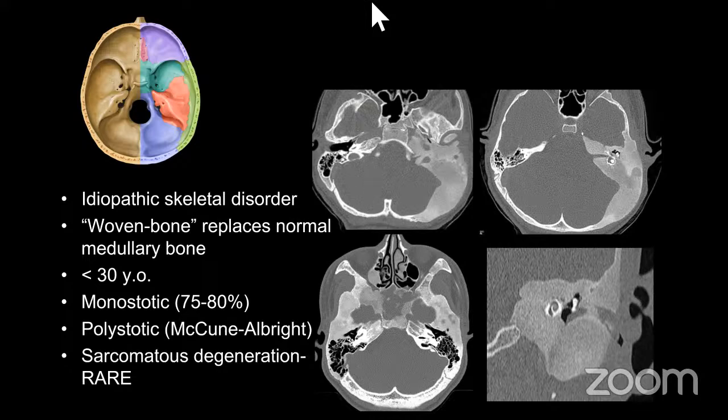Now, granted, sometimes you can't be 100%, but if you are dealing with an experienced skull base radiologist, you can see that the cortex of this bone is actually pretty well intact. And then on the non-contrast T1-weighted images, we can see these focal areas of fat. And on the T2-weighted images, you can see this bubbly appearance, but that is true fluid. So this is one example of incomplete pneumatization.